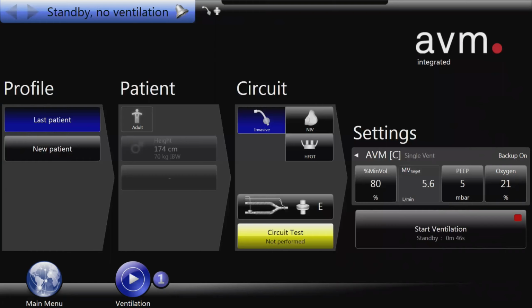So we have again those 3 test breaths. Now what I want to show you is, and also with the animated lung, just change from pressure to the animated lung. And now you see the diaphragm. So you see that the patient is breathing spontaneously. And also that the peak pressure now is coming down. So we are now already in the course for weaning.